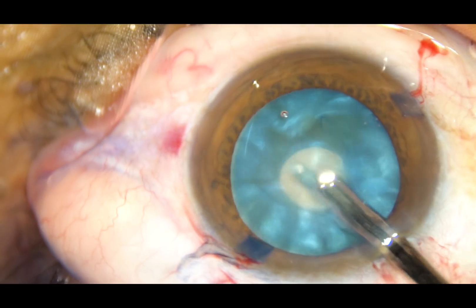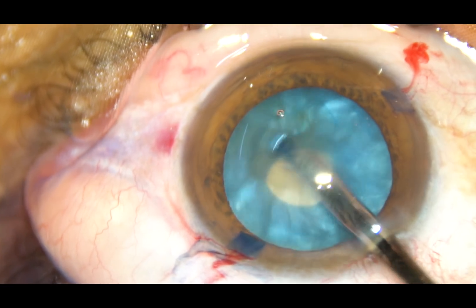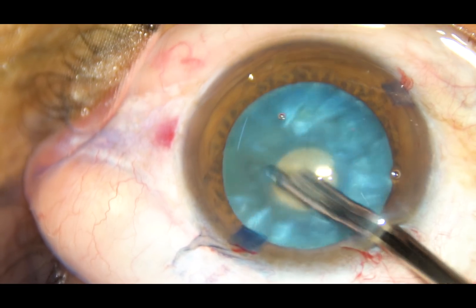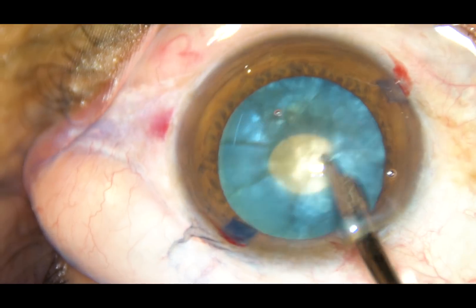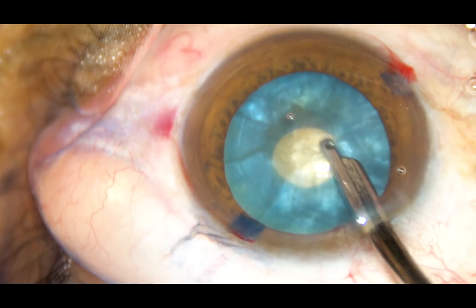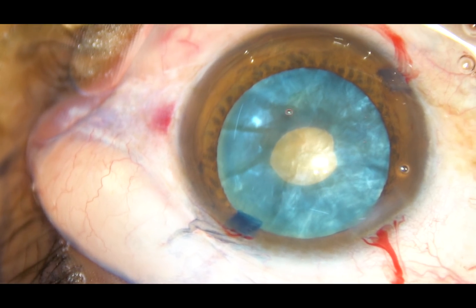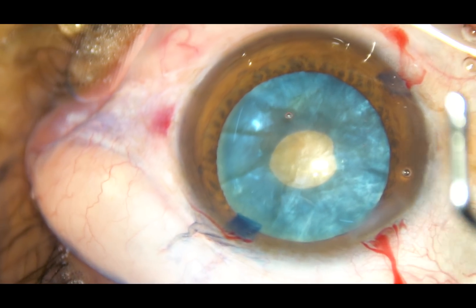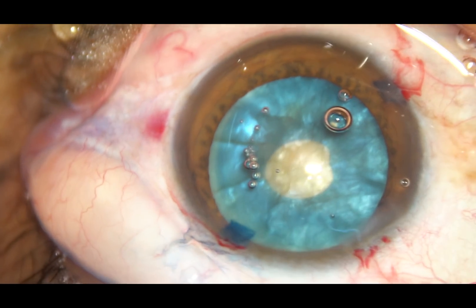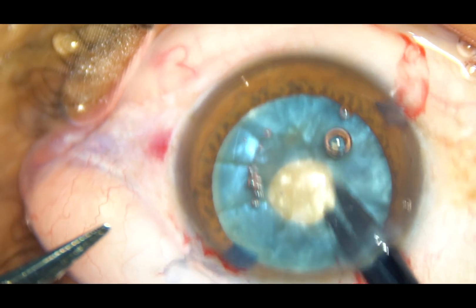Now, through this small opening, some cortical lens matter is aspirated using a Simcoe cannula — this is a 23-gauge Simcoe cannula. You can use bimanual IA or coaxial IA for aspiration of some amount of cortical matter. Now, HPMC is injected again. Since the intralenticular pressure has been reduced, this cataract will behave totally differently now.